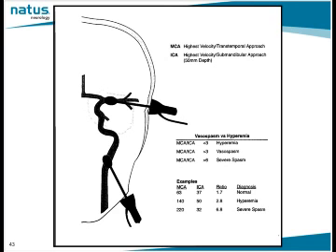The transducer is placed underneath the jaw at an angle of 0, and the extracranial ICA waveform is taken at a depth of 50. This puts us still in the extracranial circulation. We're not up in the circle of Willis, we're down in the extracranial ICA. Let's see how this works. In a normal individual, here's an example, patient MCA is 63, the extracranial ICA is 37. This gives them a ratio of 1.7, and that's well within the normal range.